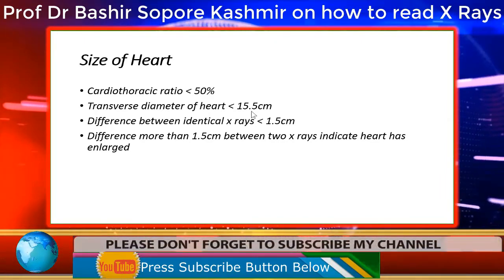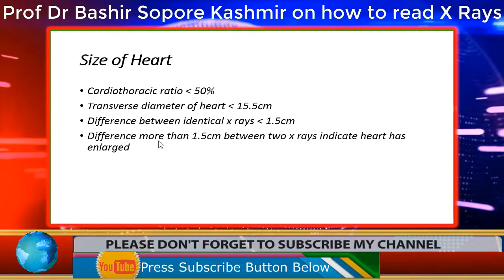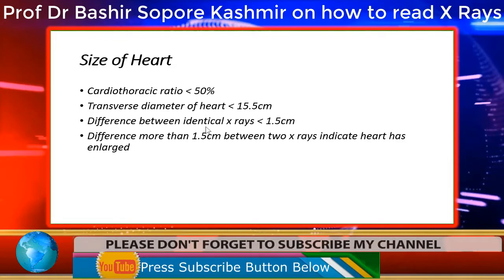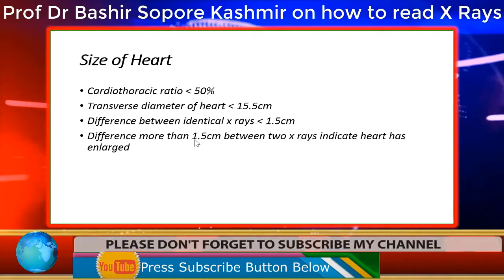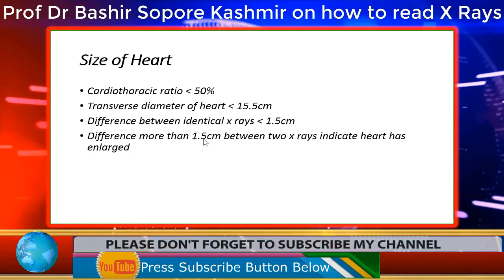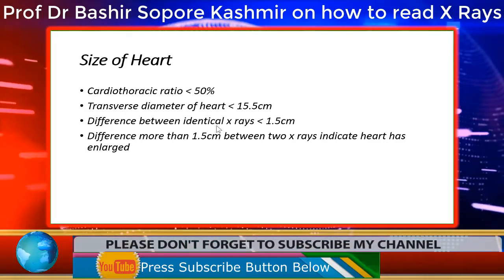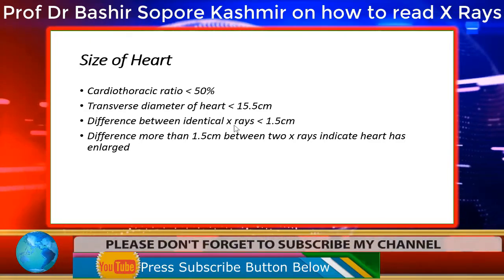You can only call it cardiac enlargement if you find that the difference between the two x-rays is more than 1.5 centimeters. So if the heart is enlarged more than 1.5 centimeters between the previous x-ray and the next x-ray, then only you can say that there is cardiac enlargement. But if the difference is little, less than 1.5 centimeters, then you will say that the two x-rays as far as the heart is concerned are identical. I hope you got this point, and I think I don't have to repeat it.